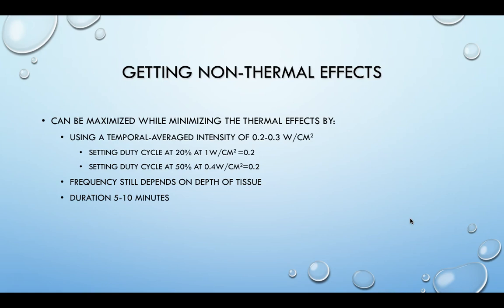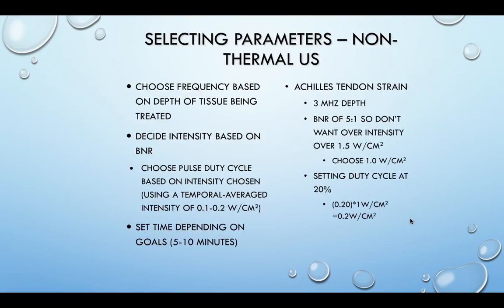And then your treatment time, because we don't have a chart, we're not trying to be tissue and tissue temperature dependent. Really, our treatment time tends to be somewhere between 5 to 10 minutes. I always recommend longer. I think closer to an 8 to 10 minute treatment. Just because if we really are trying to do that cavitation and that microstreaming, the longer we can have that going, the more likely we'll get some of those analgesic effects, and the more likely we are to change the cell membrane permeability and to have more effect on that.